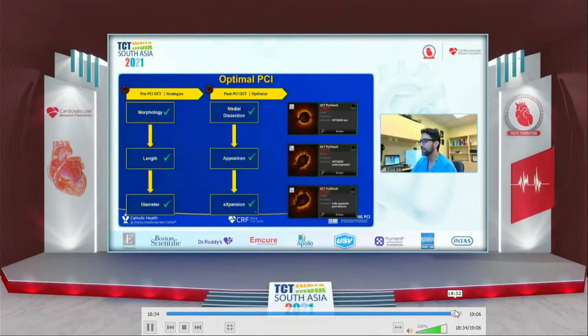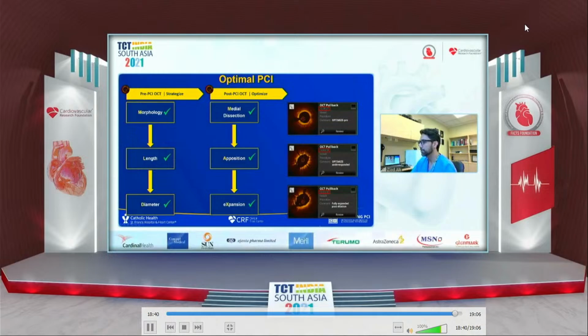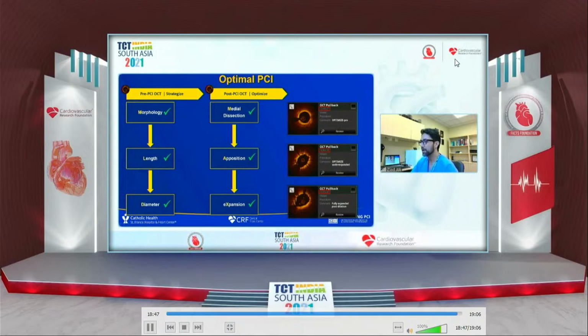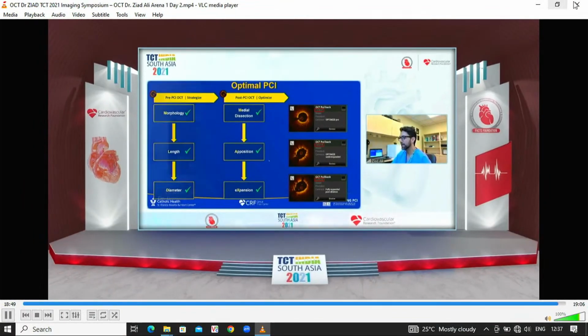Luminal wire. Yeah, very quickly. This procedure was 25 minutes beginning to end with excellent results, 100% expansion, absence of malapposition, and absence of an edge dissection. So thanks for listening to my talk on MLD MAX.